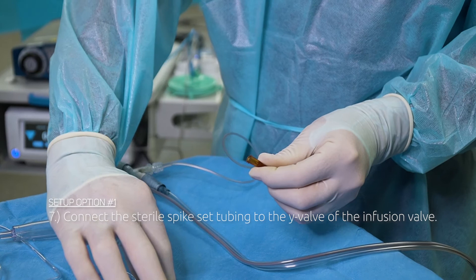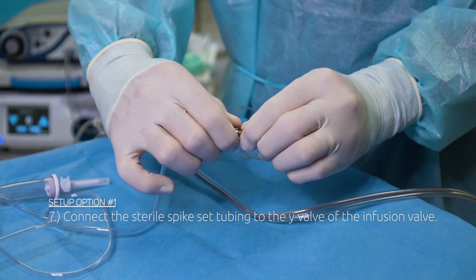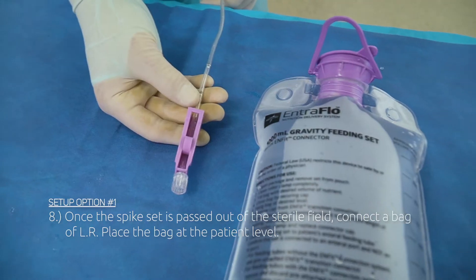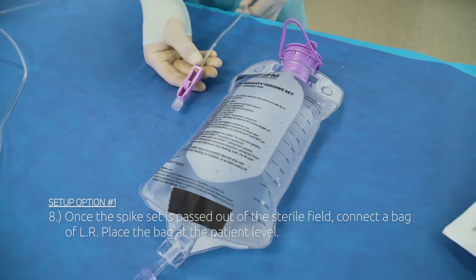Step 7: Connect the sterile spike set tubing to the Y valve of the infusion valve. Step 8: Once the spike set is passed out of the sterile field, connect a bag of LR. Place the bag at the patient level.